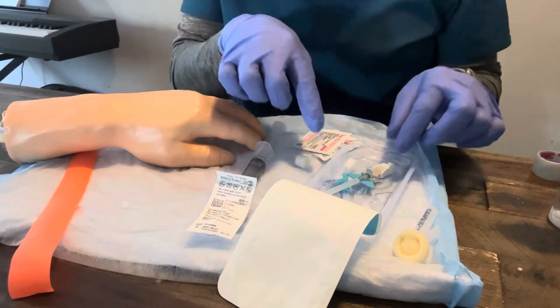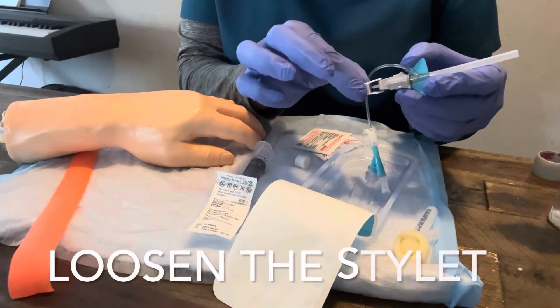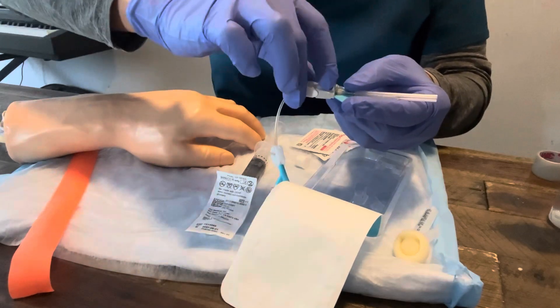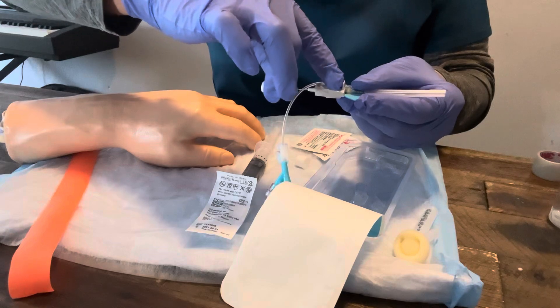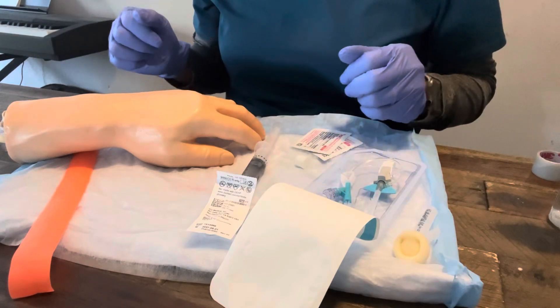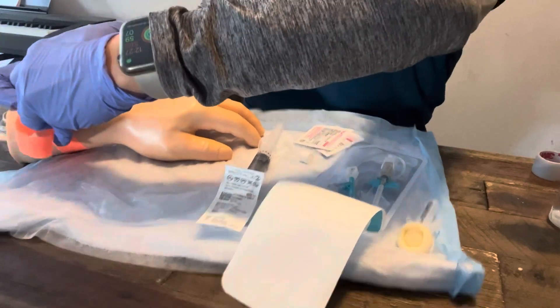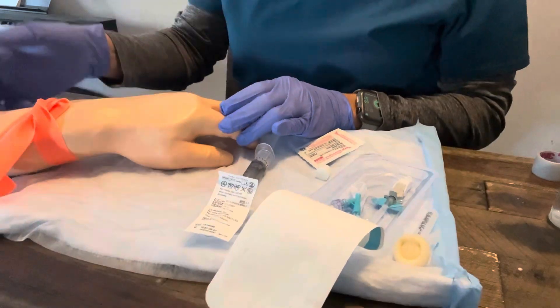I've prepped my flush and I've got my catheter. I recommend loosening it up a little bit — you don't want to fully engage it, just loosen it slightly. You're going to use your pointer finger to push the gray part forward, and use your thumb and middle finger simultaneously to engage — it's a specific motion. For our skills check-offs, we have students check distal pulses after applying the tourniquet to ensure they still feel the distal pulse. We've got our tourniquet on, our site is clean, and we're ready to go.